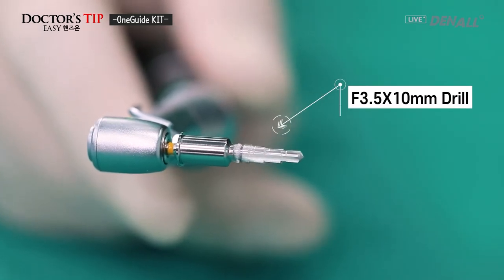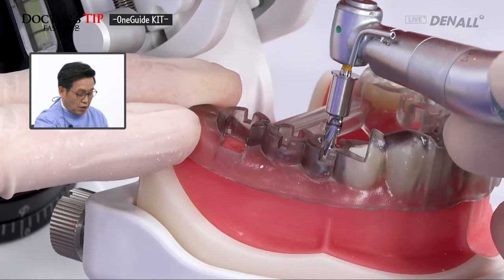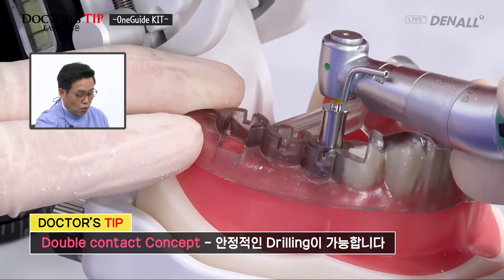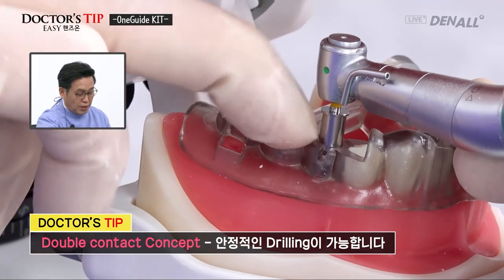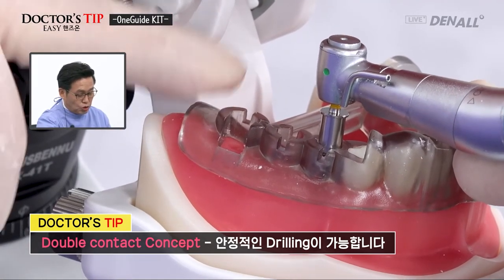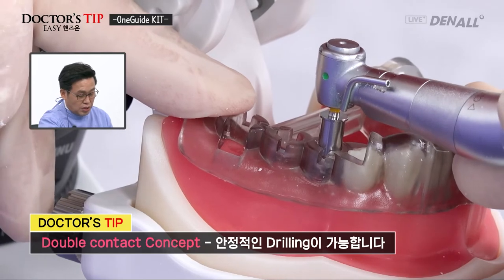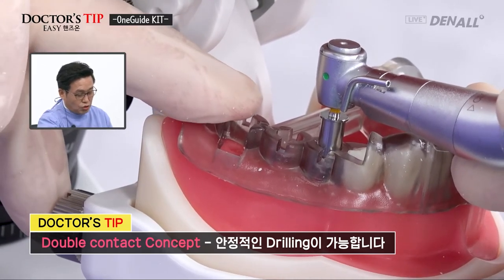3.5 by 10 millimeter drill. I've talked about the double contact concept. When you put it in the hole, the tip hits the bottom of the hole created by the initial drill, and on the top, it is in contact with the template. It is in contact with the bone structure as well as the template, so it is the double contact concept. It does not shake sideways and it is very stable.